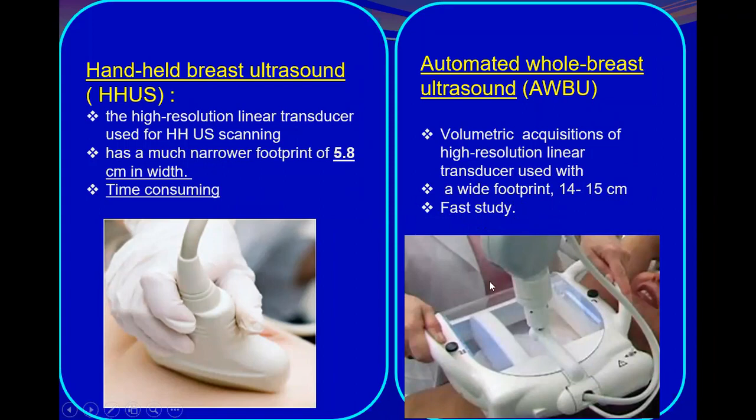So it will result in a really very fast study, while the handheld is time consuming.